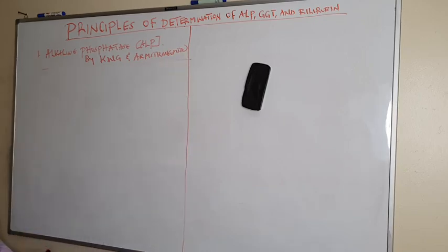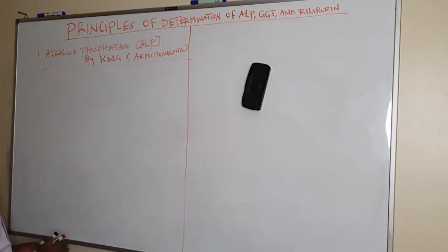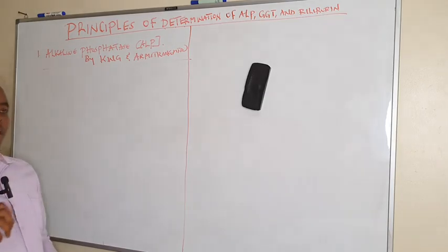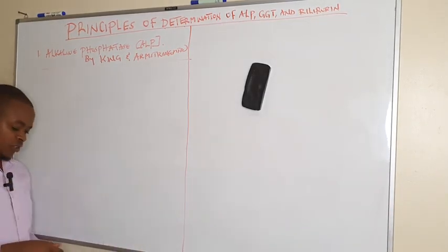And the principle here: remember, ALP is a hydrolase, or it catalyzes a hydrolysis reaction.